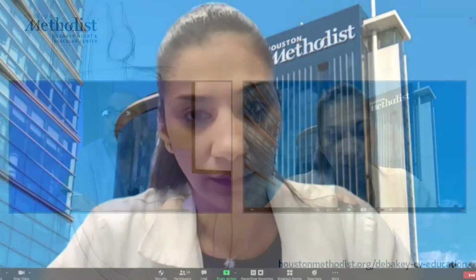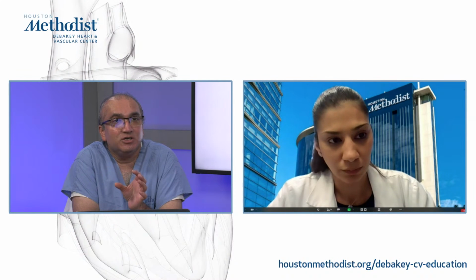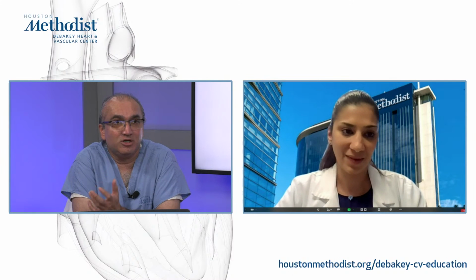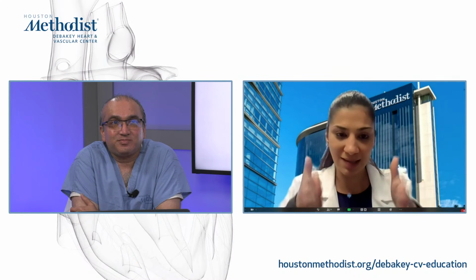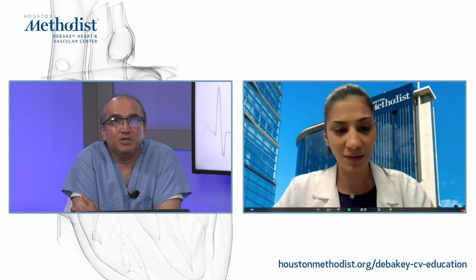Yeah, and the one thing I'll say, to me, it seems that compared to the first generation TAVR valves, the valves have gotten better as well. So we're seeing much less paravalvular aortic regurgitation than I think we saw in the very early days. Do you agree with that? Absolutely. Now they have skirts that seal and decrease the amount of paravalvular regurgitation.